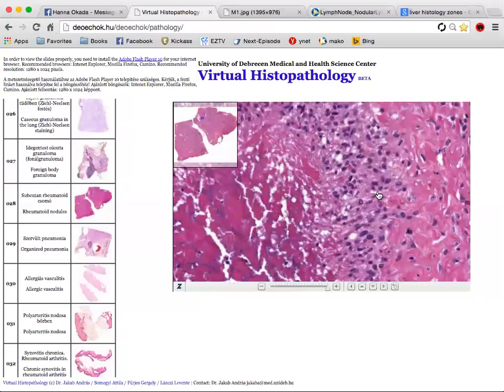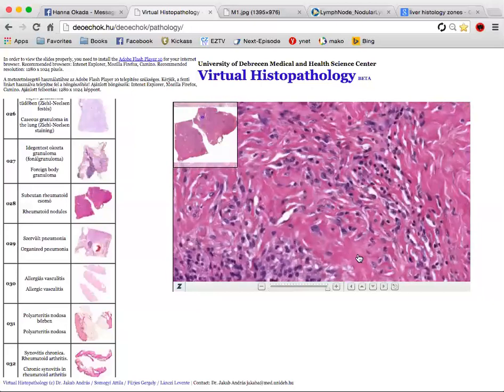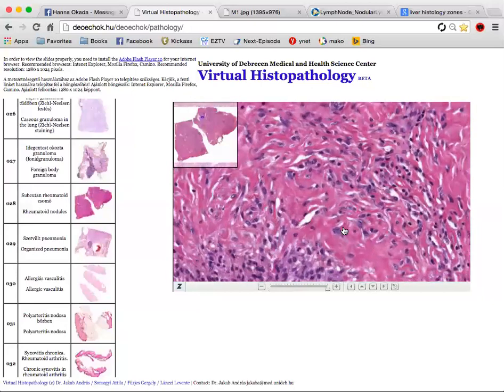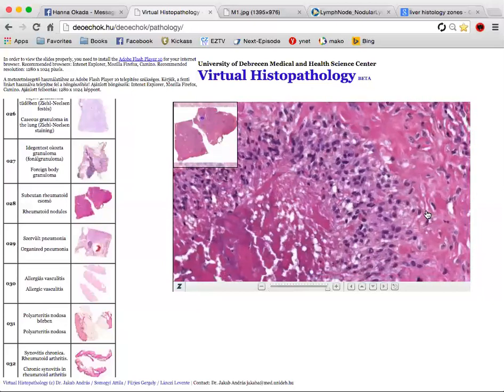So out of the epithelioid cells, we might see the giant cell. Yeah, so there might be a few giant cells somewhere here. It's just kind of hard to see because it's all densely packed. I thought I could see the giant cells surrounded by the epithelioid cells and lymphocytes, but it's not.